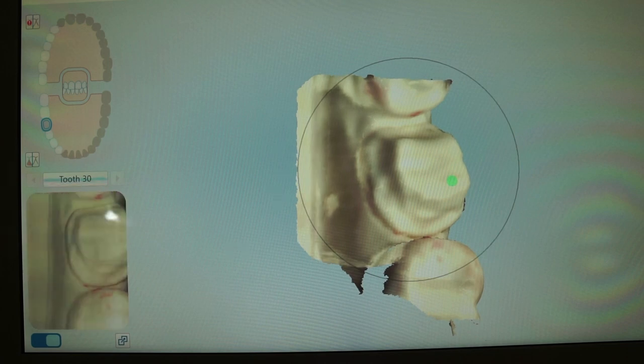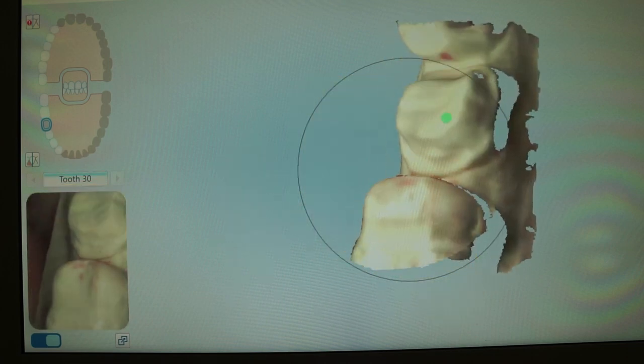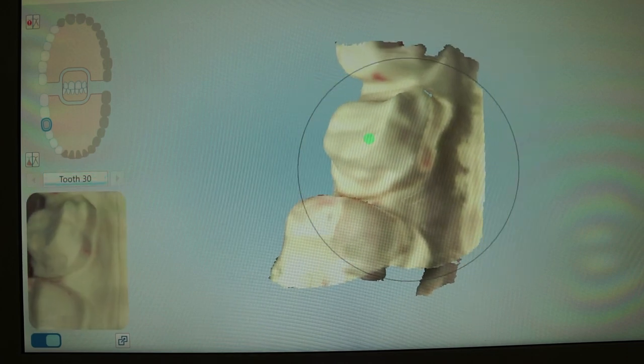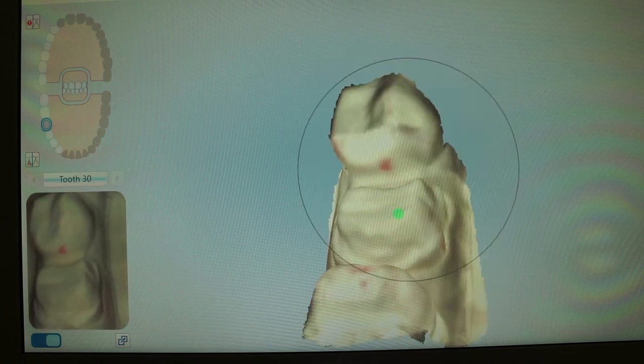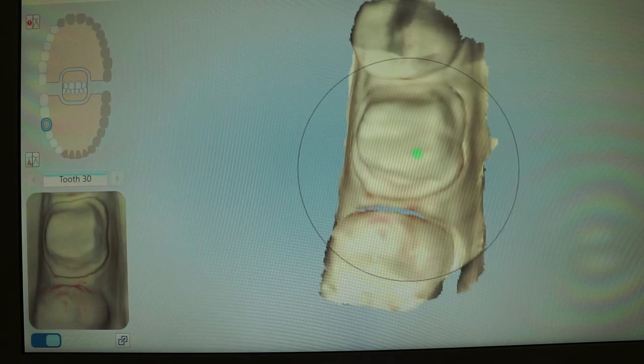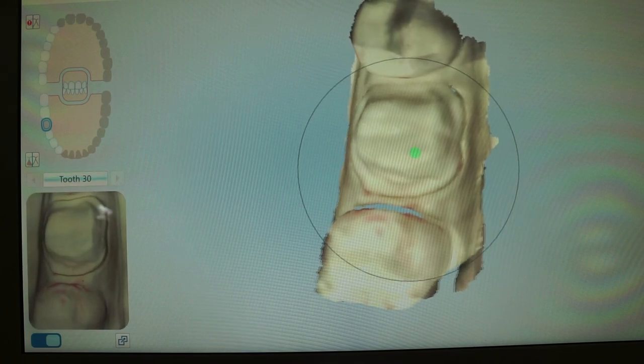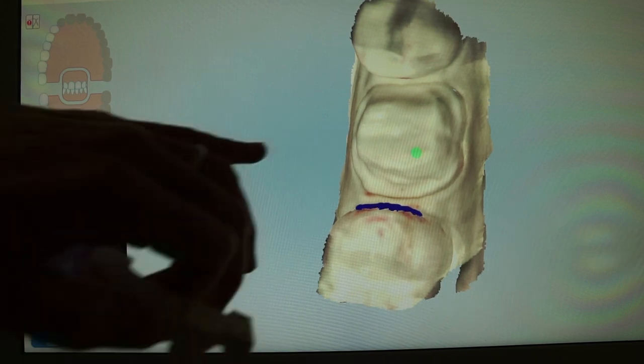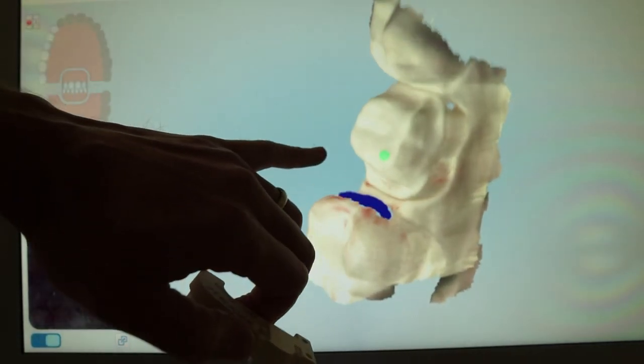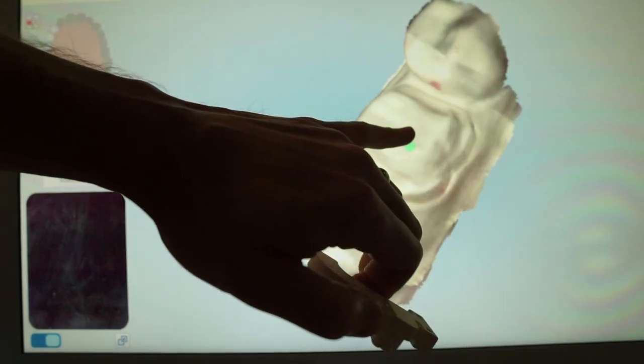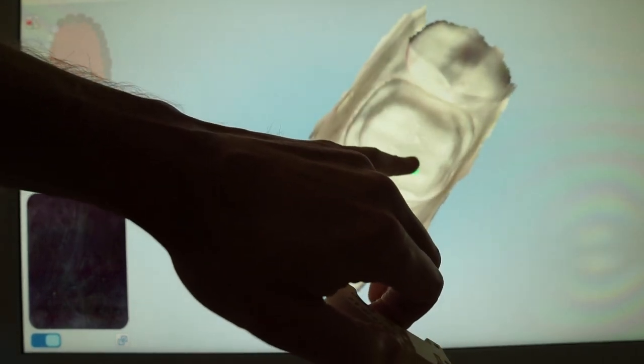And in this first scan, all you really need to do is try to get as much good detail on your preparation as possible. I'm told this scans at a little bit of higher level of detail and accuracy. So it's a good thing. You don't need the contacts in this scan, but you do want to make sure you have the entirety of your prep.